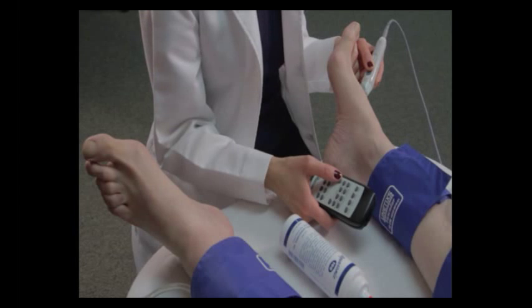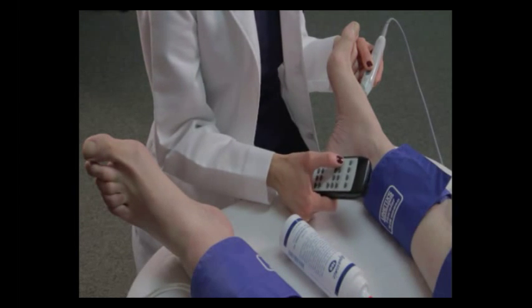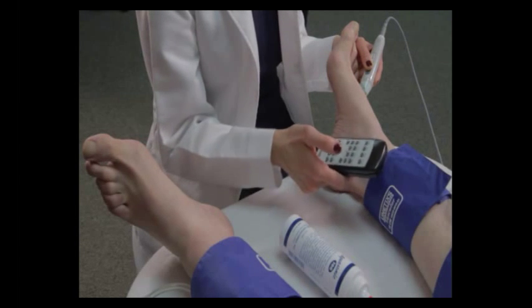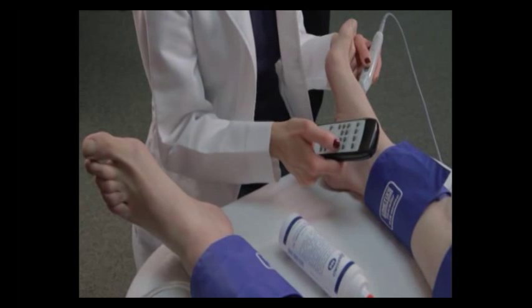The angle of the Doppler is again going to be 45 degrees to the vessel. Wait until you obtain the strong, sharp signal, and then press the inflate button on your multi-lab remote.